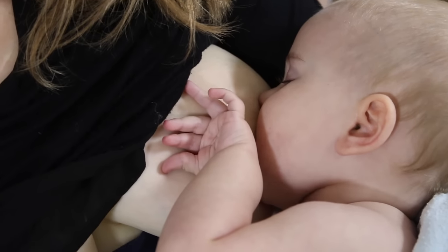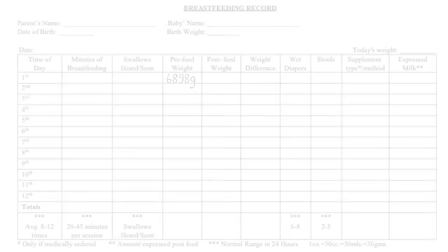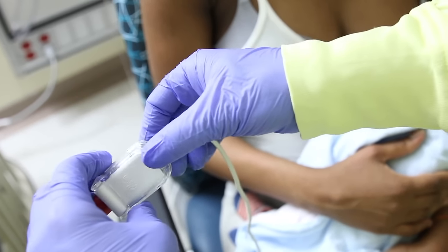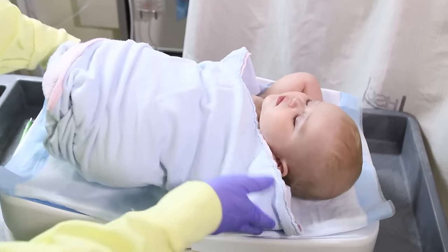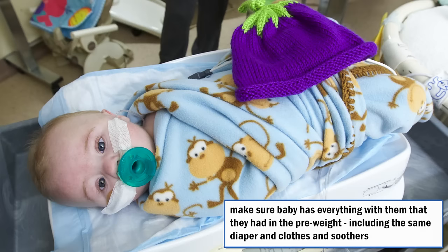The scale will automatically zero. Record the pre-feed weight on the breastfeeding record. For a baby who has leads disconnected, reattach the leads for the feed. Immediately after the feed, bring the baby back to the scale. Ensure the scale is in the same position relative to the crib or isolette as for the pre-weight, and the baby has everything with her on the scale as for the pre-weight, including the same diaper.